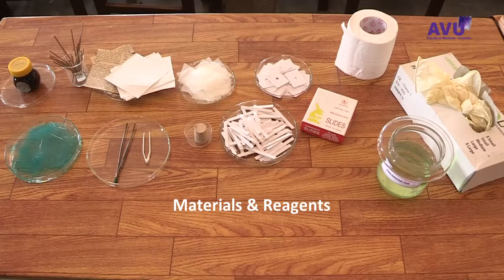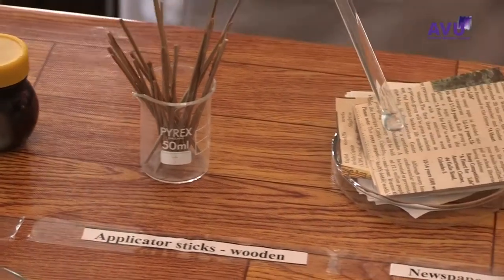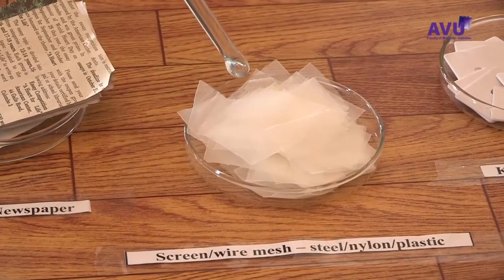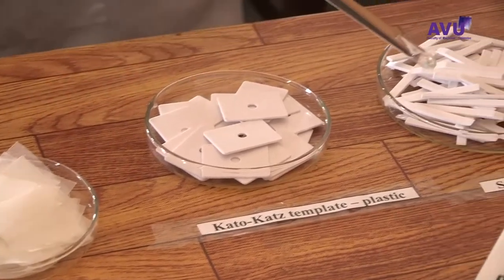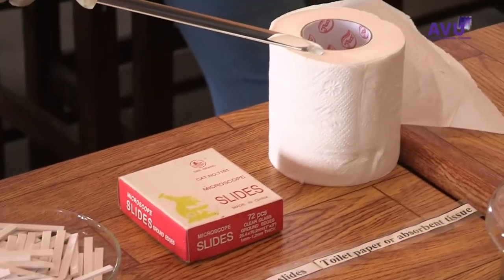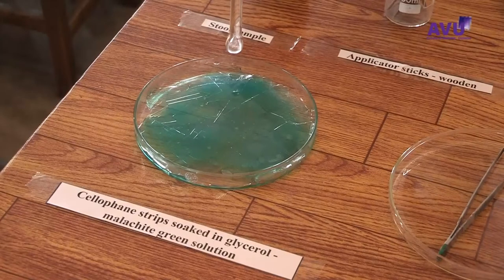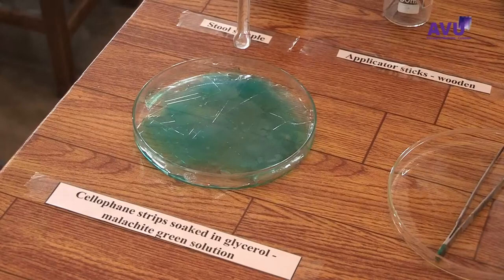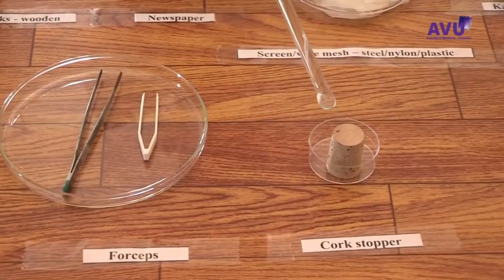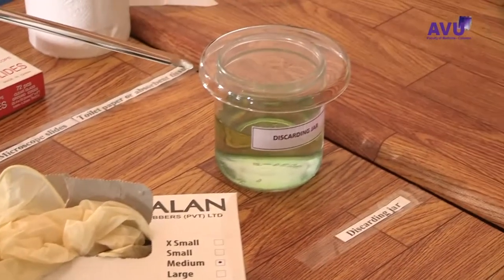Materials and Reagents: Stool sample, applicator sticks (wooden), newspaper screen or wire mesh, Kato-Katz template, spatula, microscope slides, toilet paper or absorbent tissue, cellophane strips soaked in glycerol malachite green solution (methylene blue solution can also be used), forceps, cork stopper, gloves, and a discarding jar with disinfectant.